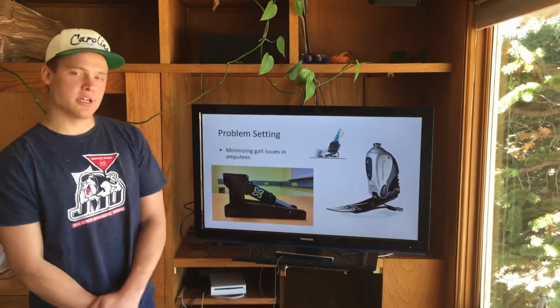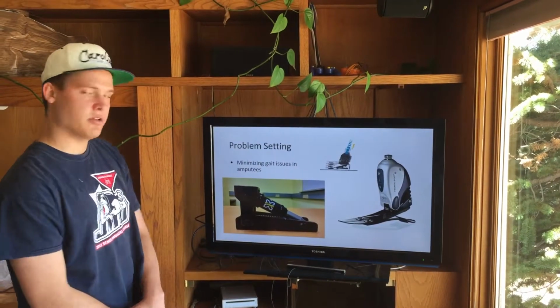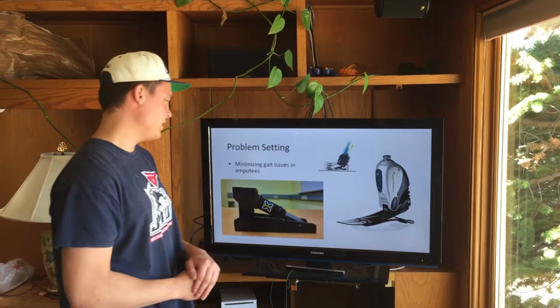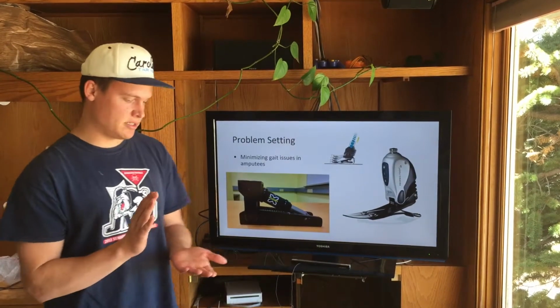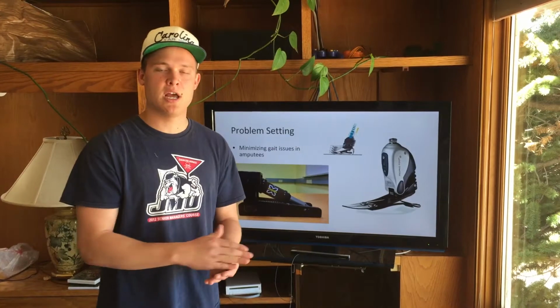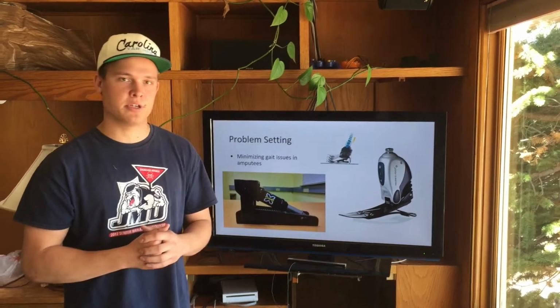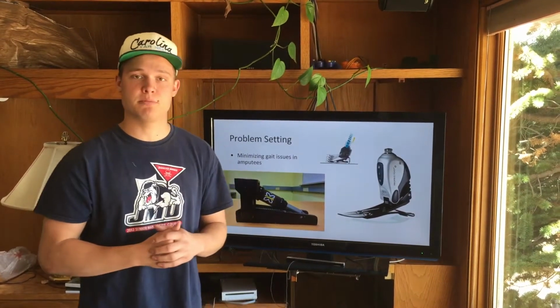Just a quick introduction to our project: we'll be doing a below the knee or below the hip amputee prosthetic motorized foot, because historically amputees have had problems with their gait. As they walk, instead of naturally rotating as a typical foot does, it's more of a rigid motion, and that sometimes has negative effects on their stride, their gait overall. So our project is hopefully going to be minimizing some problems like that for future amputees.